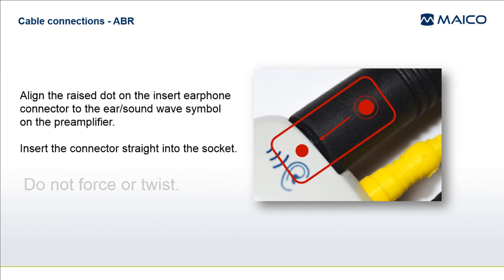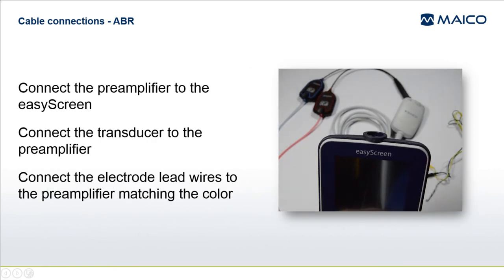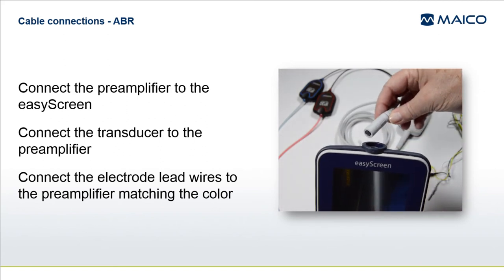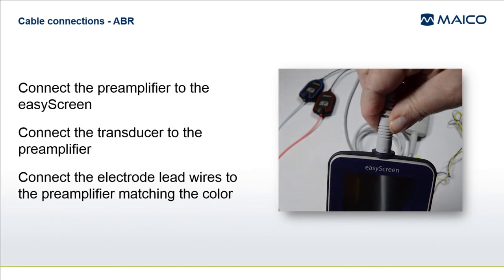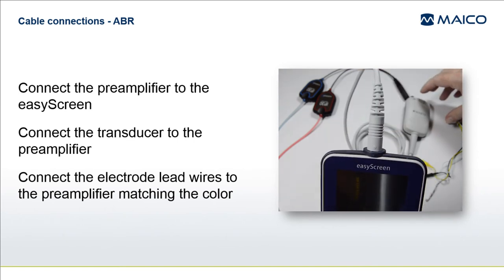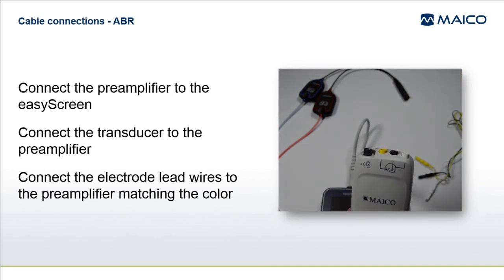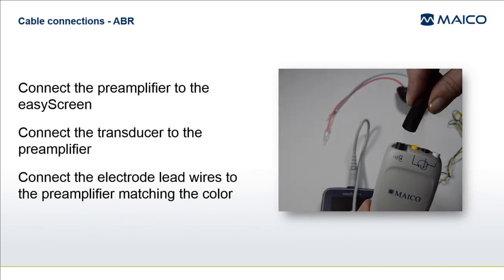Likewise, when you remove the connector from the socket, carefully pull it straight out, being sure not to twist. To assemble the EasyScreen for performing ABR testing, connect the pre-amplifier connector into the socket at the top of the EasyScreen. Connect your chosen transducer connector into the socket on top of the pre-amplifier that is labeled with an ear and sound wave symbol. The dot on the connector should be aligned with this symbol.